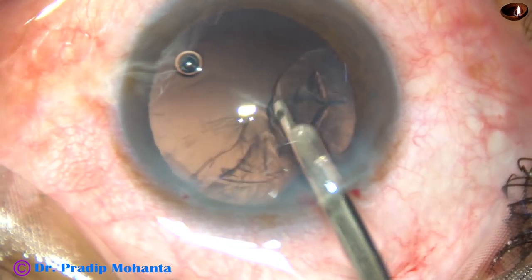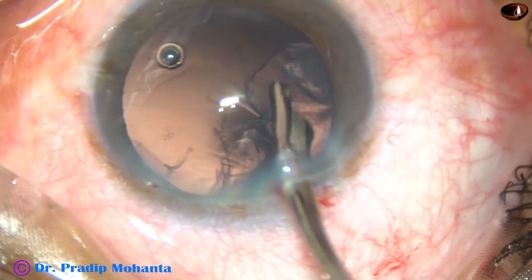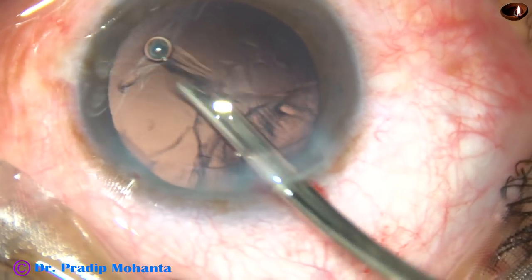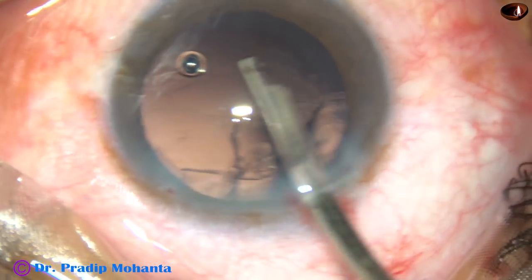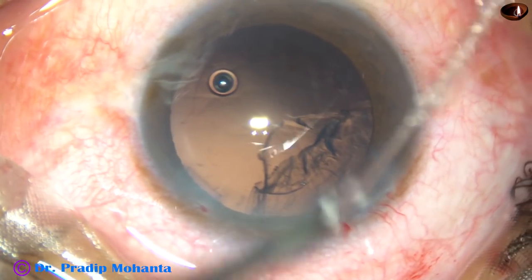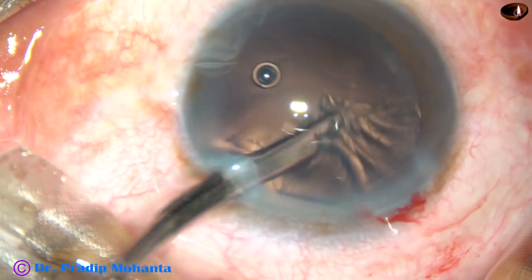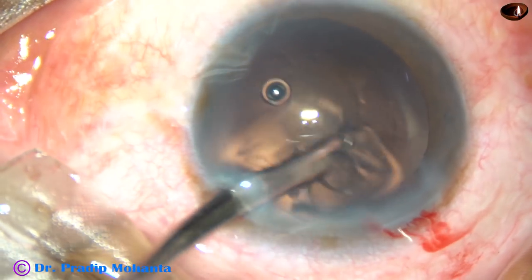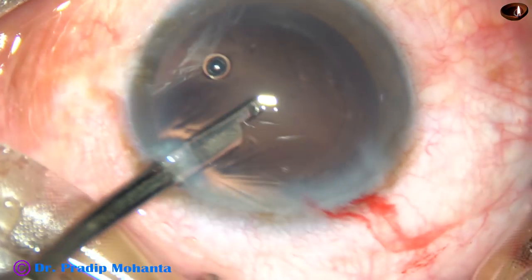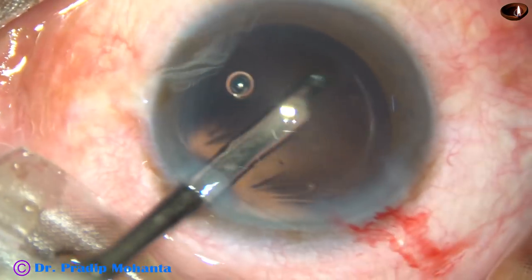Now, cortical cleanup is being done. In this case, I have made only one side port, so I am using this instrument — a 23-gauge Simcoe cannula. You can use a coaxial I/A also. And here it is — the cortical matter has come out.